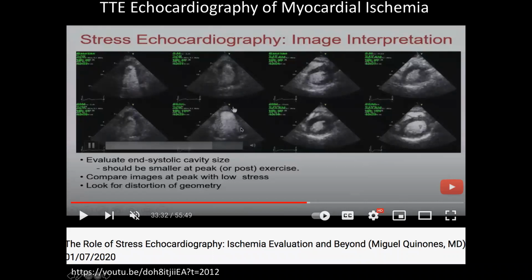And they do this, I don't know what percentage of the time they do it now, but you can get just off the shelf microbubbles, and they're essentially tiny little bubbles, and you put them in a syringe and you inject them into the patient, right? And they're micron-sized bubbles. And so they just get absorbed. They don't cause any deleterious effects. However, they are hugely echogenic, right? In the sense that you get 100% reflection off these bubbles.